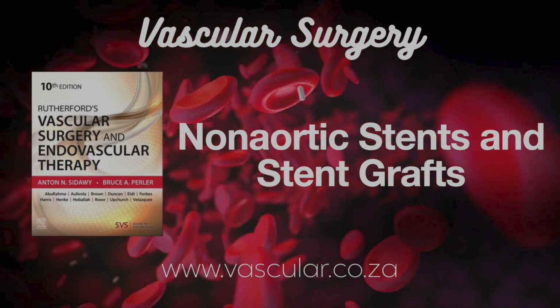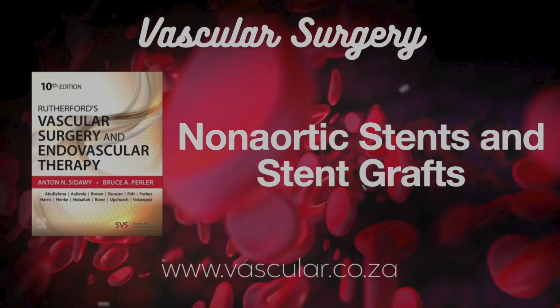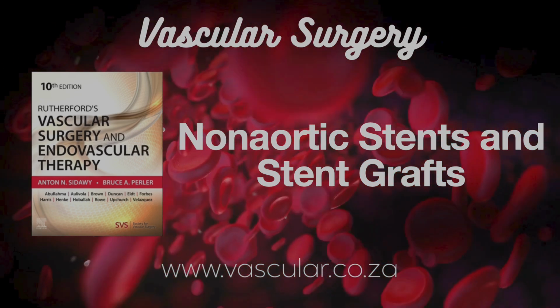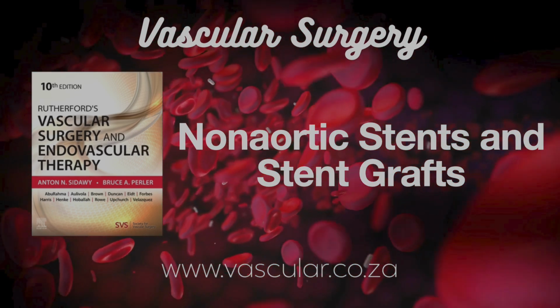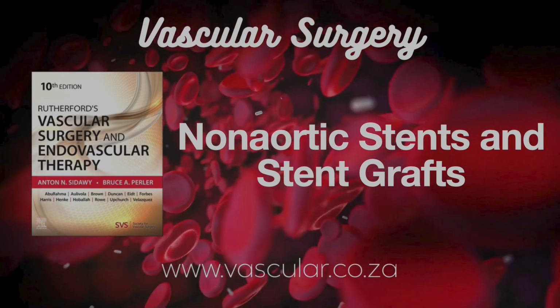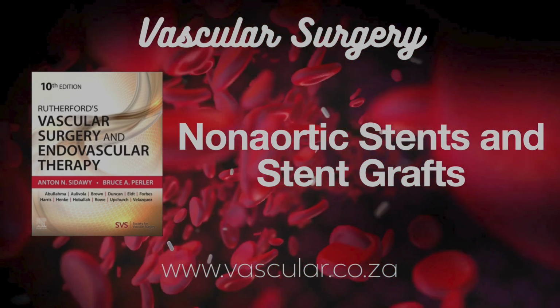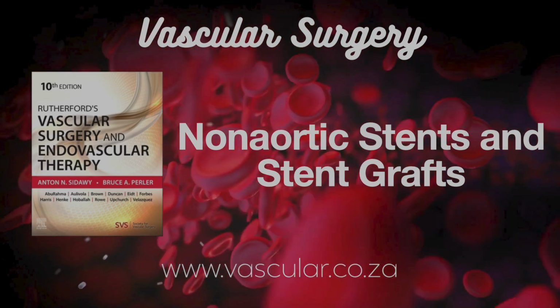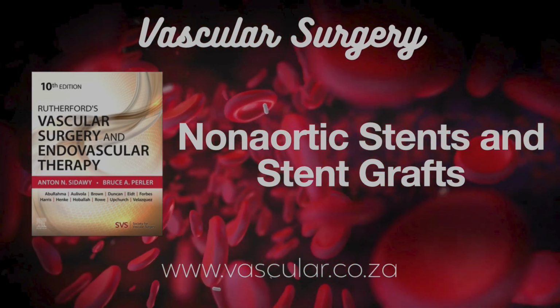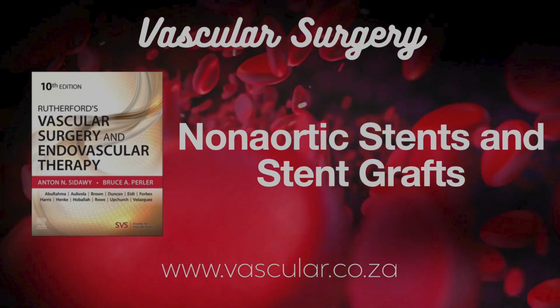Okay, let's look ahead. New horizons. Absorbable stents. Yeah, bioabsorbable scaffolds. The idea is great. Provide support while the vessel heals, then disappear, avoiding long-term implant issues. How are they doing? Early results in coronary arteries were okay, reducing tissue growth. But in peripheral arteries, especially the leg, the results have been kind of disappointing so far. Some early ones actually had lower patency rates than standard stents. One coronary version was even pulled from the market. So, not quite ready for prime time in the legs yet.